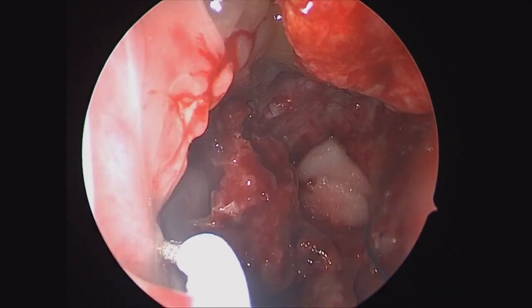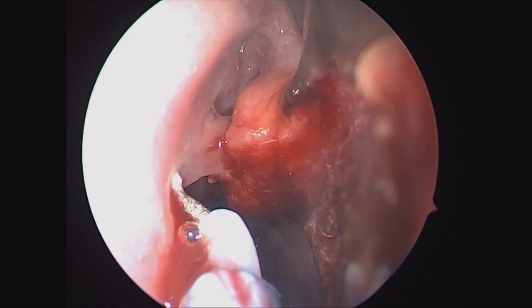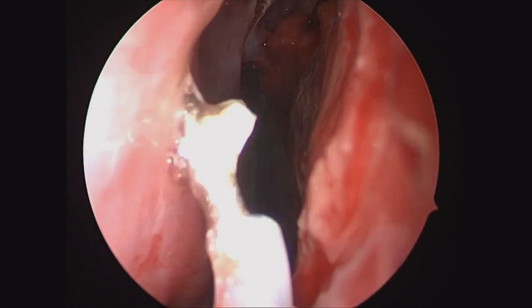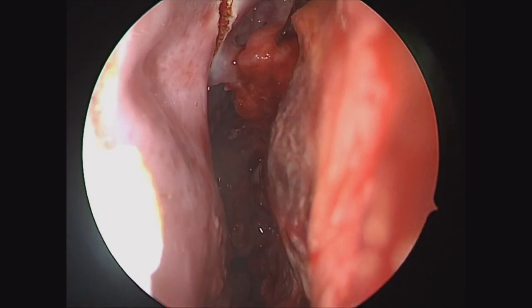I'm bringing this up high onto the lateral nasal wall in order to maximize our distal paddle of the flap, in order to give us as much distal mucosa to cover her defect as possible. We'll then bring this incision along down towards the head of the inferior turbinate. In selected cases, you can also raise this as an extended inferior turbinate flap and bring this incision the whole way down onto the mucosa of the nasal floor or even the nasal septum, if needed.